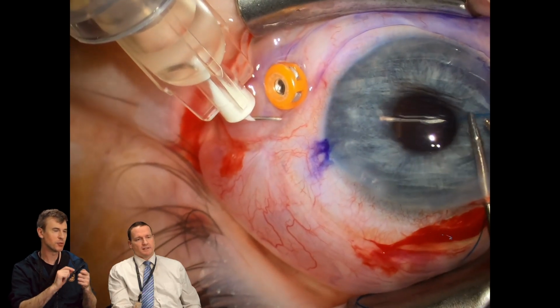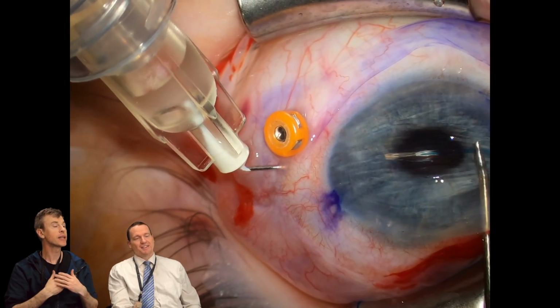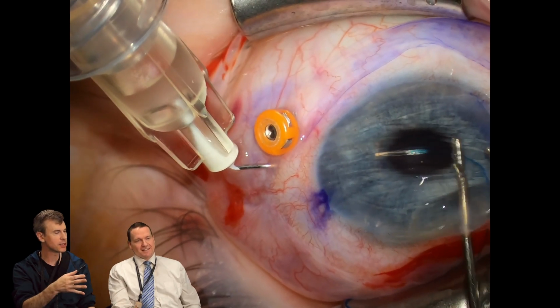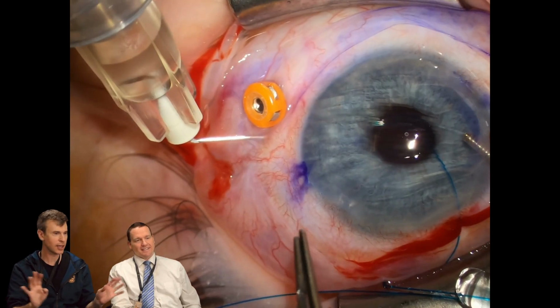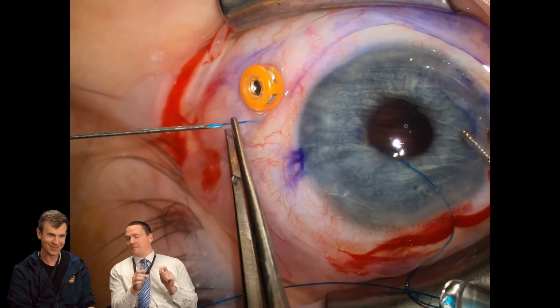I'm measuring, I'm doing millimeters on a caliper. These are not very predictable cases in my hands, so I just want to make them better. If I can get them into glasses that work, I'm very happy. It looks like literally threading a needle, but while you're inside of the patient's eye.